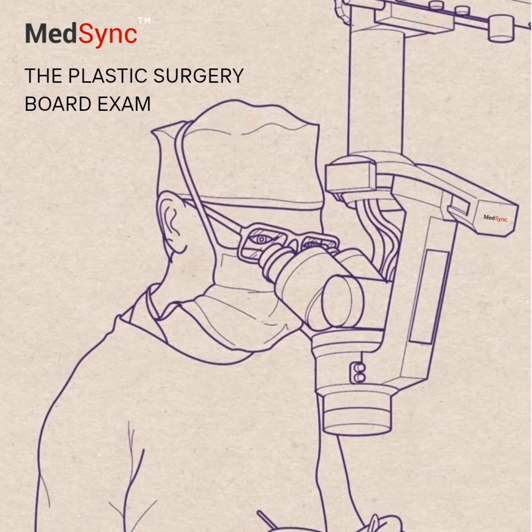And what do you see on X-ray at the end of consolidation? Interestingly, often not much clear bone yet. Radiographically, the regenerate might still look quite faint or hazy when it's time to remove the device. You don't need to wait for a fully corticated bridge on the X-ray. Good to know. Okay, where is DO typically used? What are the main indications?